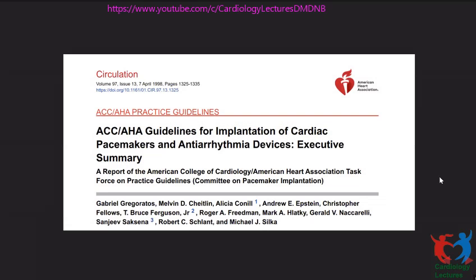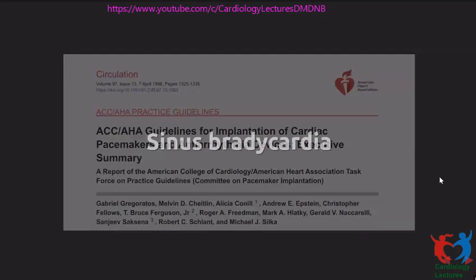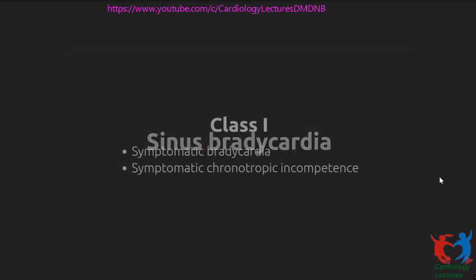To come to the specific guidelines, I'll primarily discuss guidelines for indications for pacing, and the two main categories for which we pace patients are sinus bradycardia and AV block. To some extent, the split between the two will vary between institutes, but mostly it is like a 50-50 split, or can go to about 30-70 like us, so it varies a little bit. But these two form the primary indications of pacing, and 95% of patients who undergo a pacemaker implant fall into one of these categories. So these are the two things into which I would go into a lot of detail. We'll start off with sinus bradycardia.